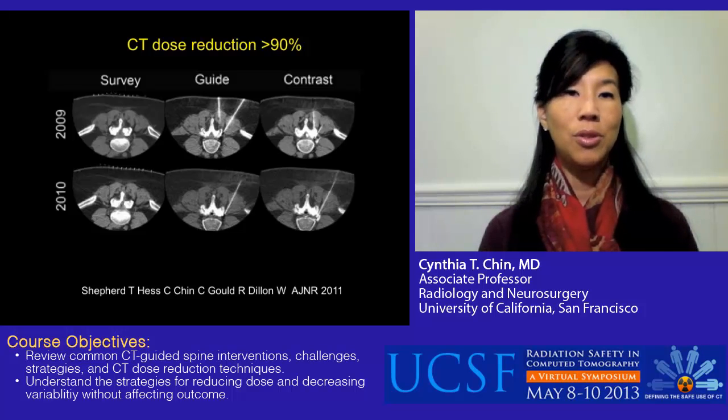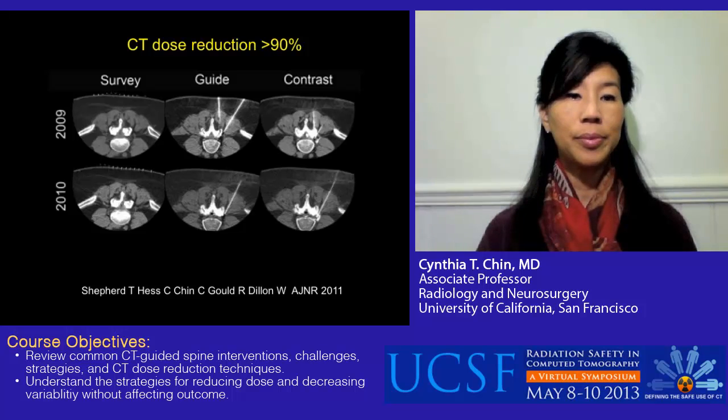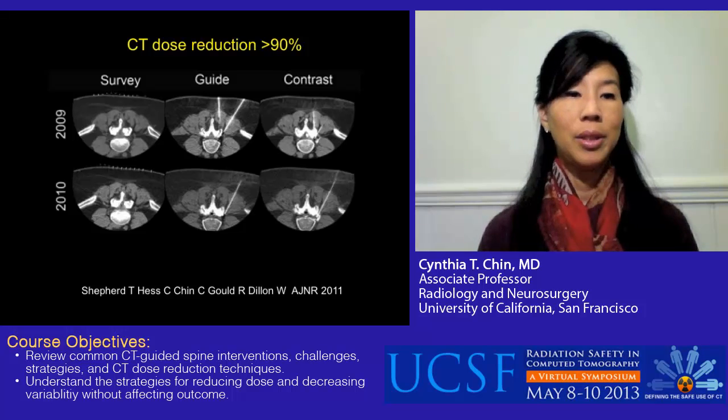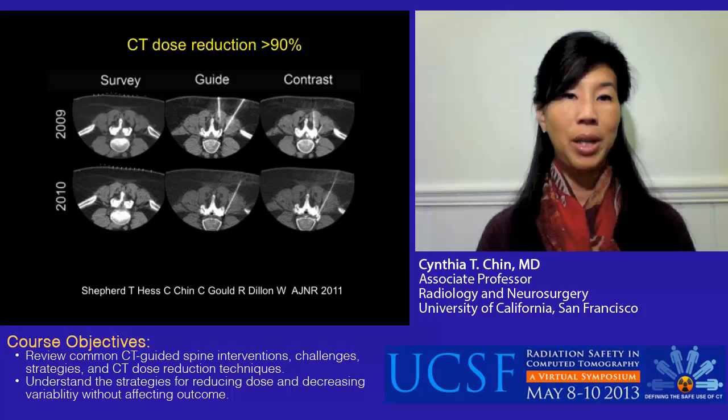phases of the procedure was significantly decreased in 2010, with the survey view in 2009 of greater than 500 MA decreased to less than 200 for the survey view in 2010. In fact, it was at 150 MA. For the guide view, MA was decreased in 2009 from 84 to 30 MA.